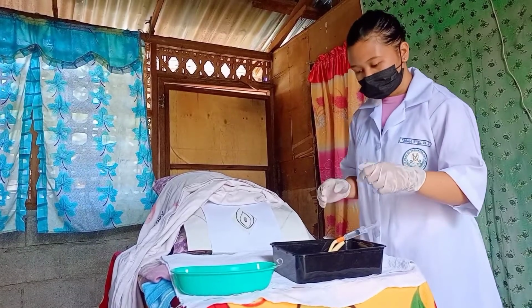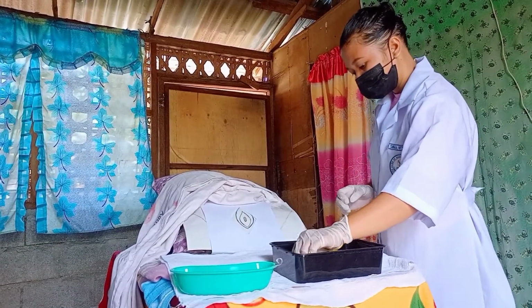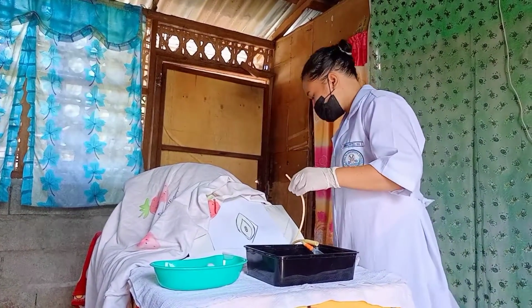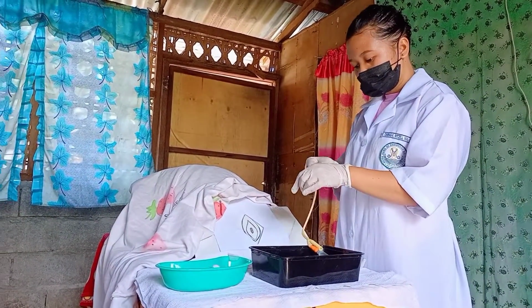So for lubricating the tip, 1 to 2 inches for the female. And then for the male it is 6 to 7 inches.